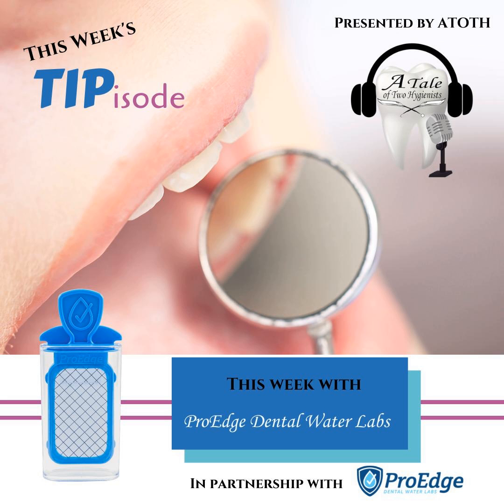They're all safe. If you fail, and I know you're going to ask this, Mr. Devil's Advocate, you don't know which one caused the failure. That's right. But you're going to shock all those lines anyway, because that's the best 3-step protocol. You're going to shock every line. And then you may want to retest using individual samples to troubleshoot and find out which one caused the problem, which is often that Cavitron or that scaler, because the lines are longer, the water sits stagnant, and it's harder to shock. Cavitrons fail 50% more often. That's what the data shows. But that's a great question, Andrew.